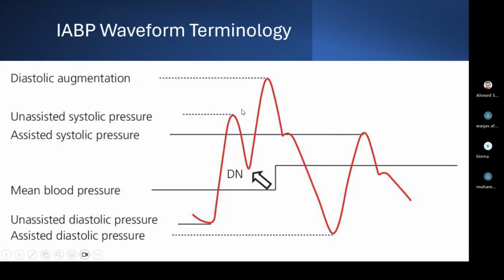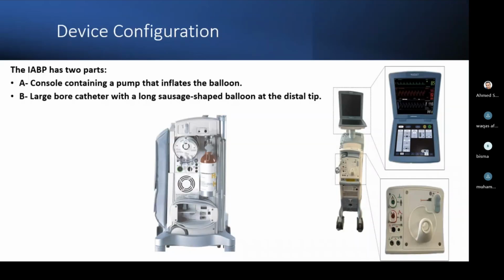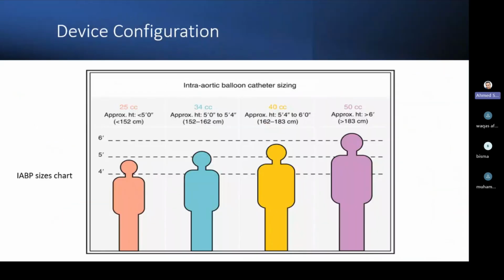That's good. Actually, it's not exactly a question, it's just a query. When we are selecting the balloon catheter sizes, we have two sizes which are similar to each other. One is this 7 Fr 40 cc, and the other one is 8 Fr 50 cc. There is a 7 Fr 40 cc available, and there is an 8 Fr 50 cc.